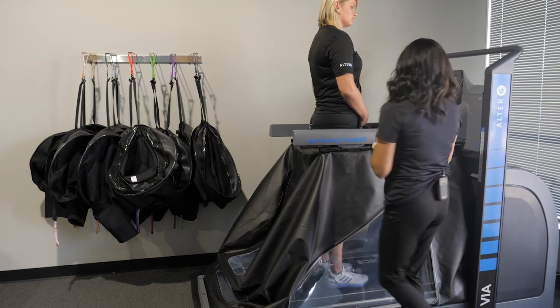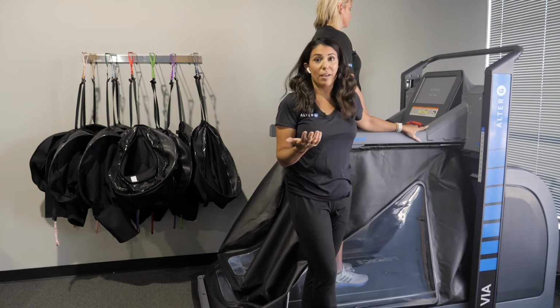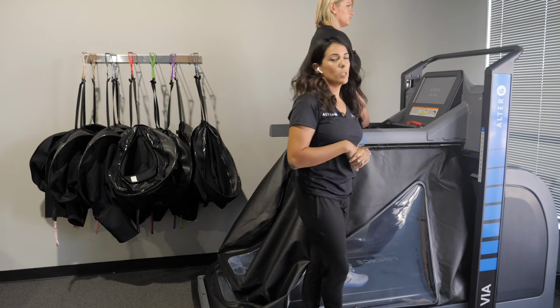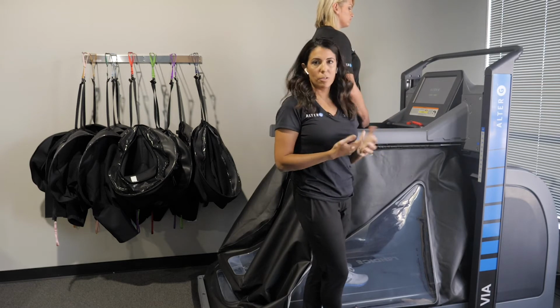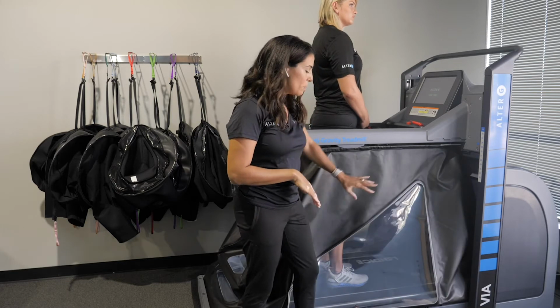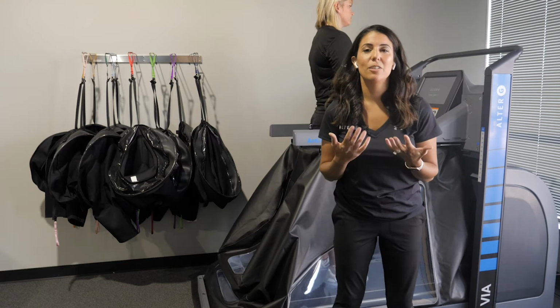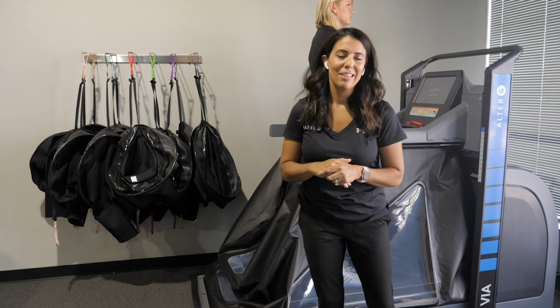Our software now takes you through what to do next. All we're going to do is press start session, and then it'll allow us to start calibrating the machine. What we're going to see happen is this bag is going to start inflating. So let's take this time to talk about the technology that allows us to unweight patients.